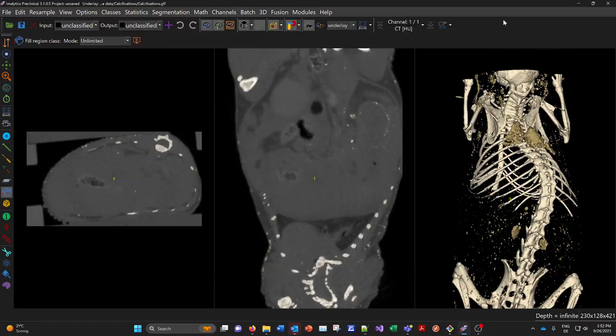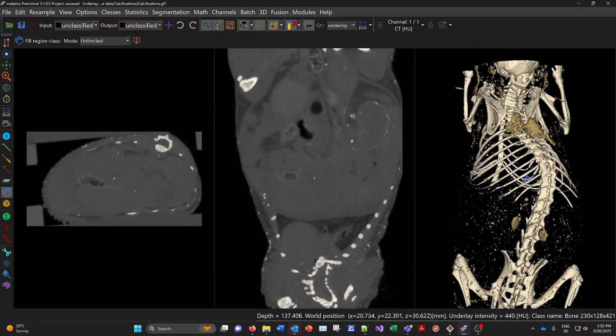Hello, welcome to this video. Today I will show you how to segment and quantify calcifications in a mouse scan from a MicroCT.